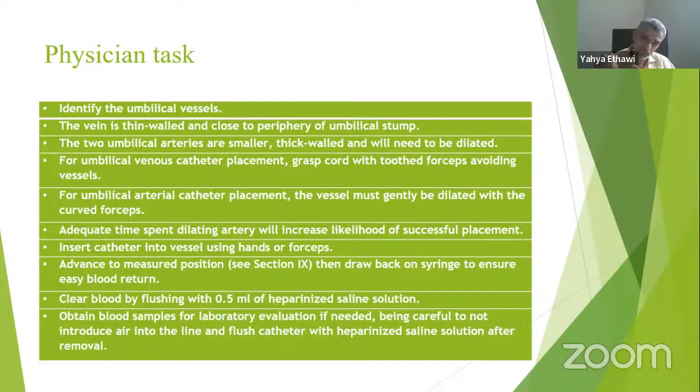Obtain blood samples. This is very important to clear because remaining blood in the lines can cause infection. Obtain blood samples for laboratory evaluation if needed.